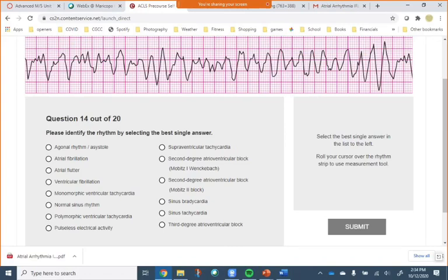So do you think these are regular or irregular ventricular beats? They are irregular ventricular beats. Like if they all looked like this, then we could probably call it a VTAC.